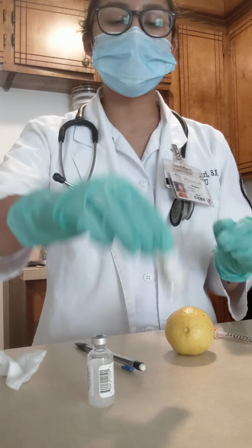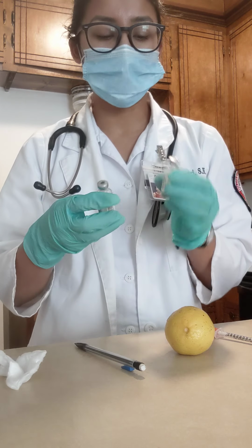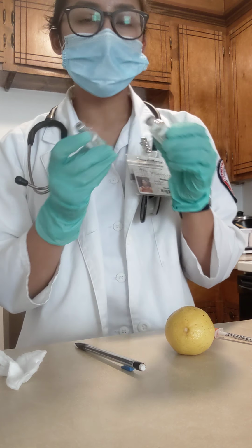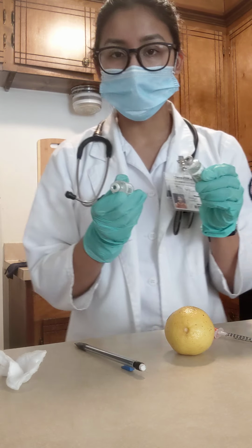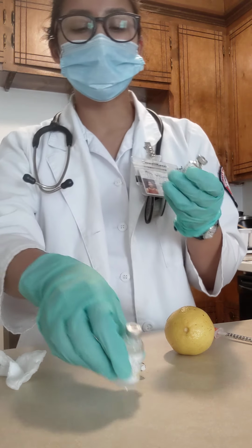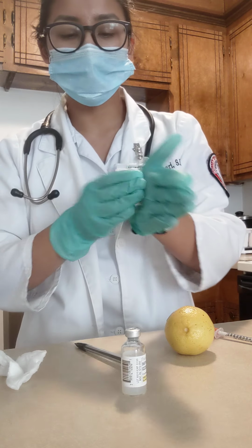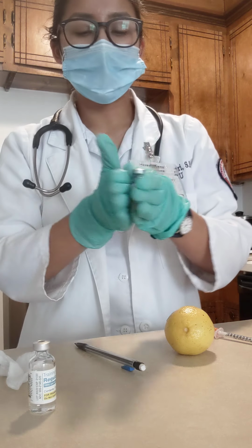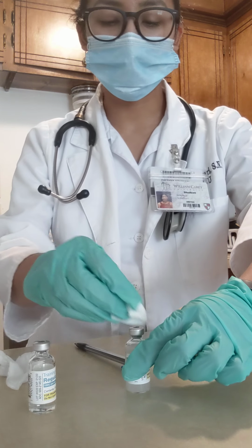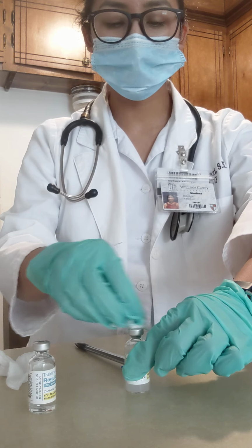So now I'm going to take my insulin vials, regular insulin and NPH insulin, and compare them to the MAR to make sure I have the correct medication. I'm going to check the expiration date and roll the vial. Now I'm going to clean the top of the vial with a clean alcohol swab in a circular motion.